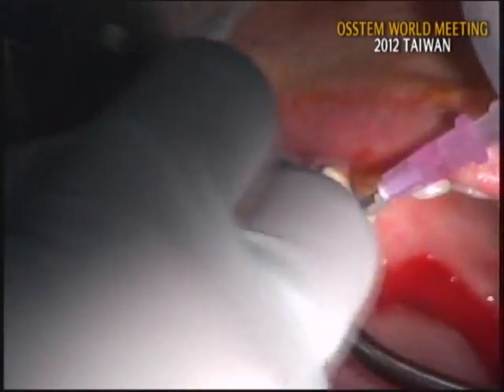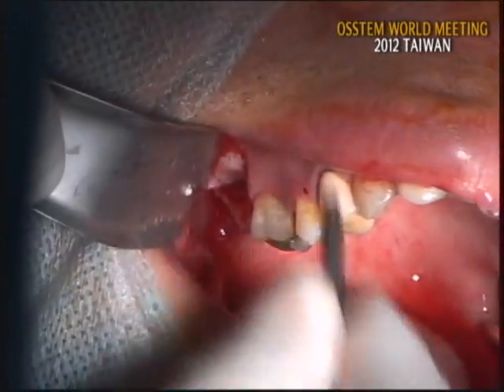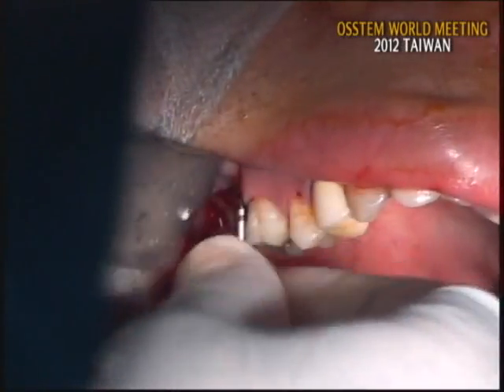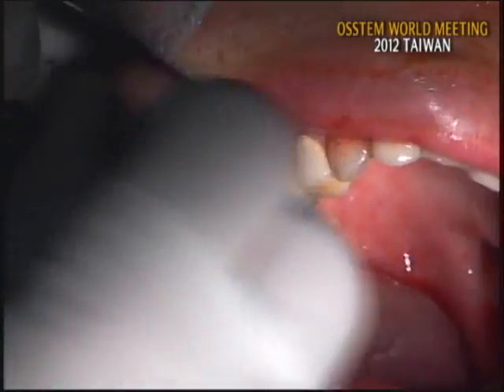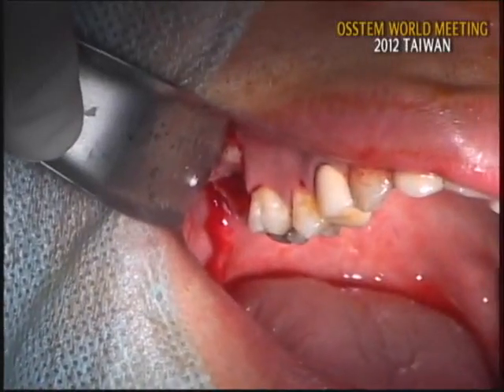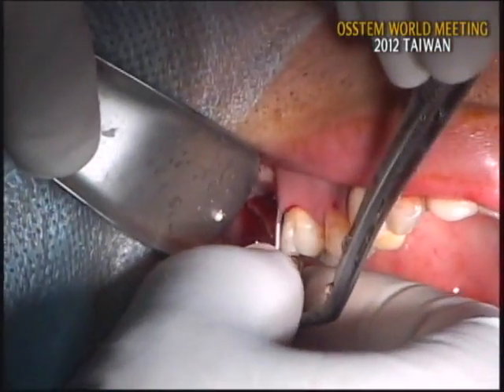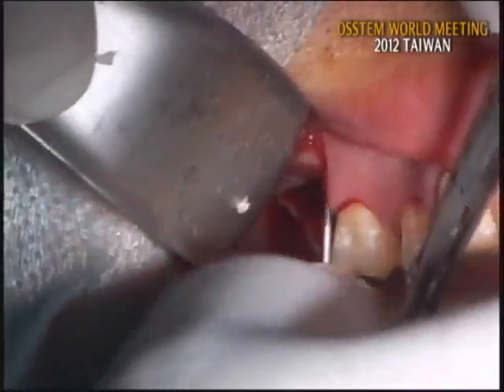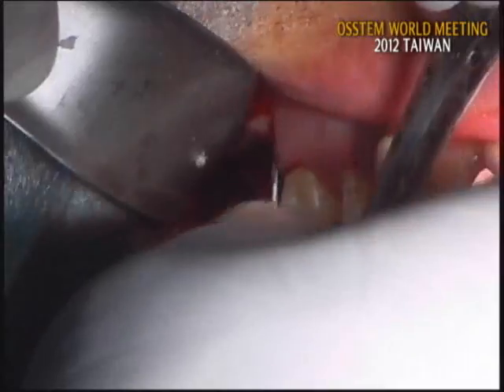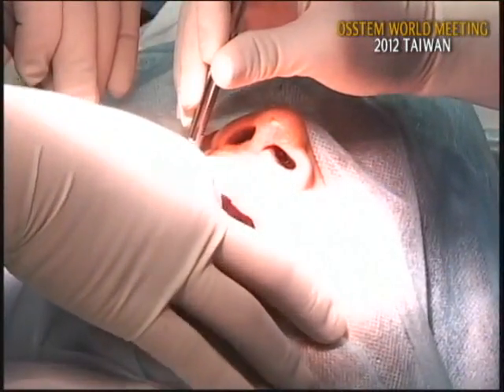Okay, I'll control the depth with the fixture driver. Connect the fixture driver and finish the depth. Okay, cover screw, please. Okay, I'm connecting the cover screw. You see, my assistant always protects the driver so it does not drop. Okay, connect the cover screw with a light force.